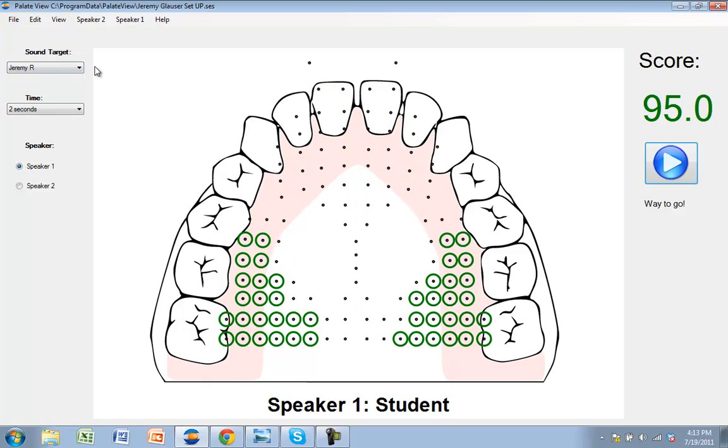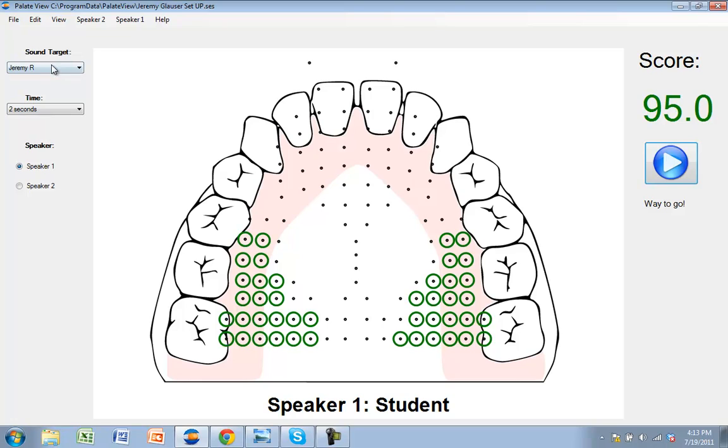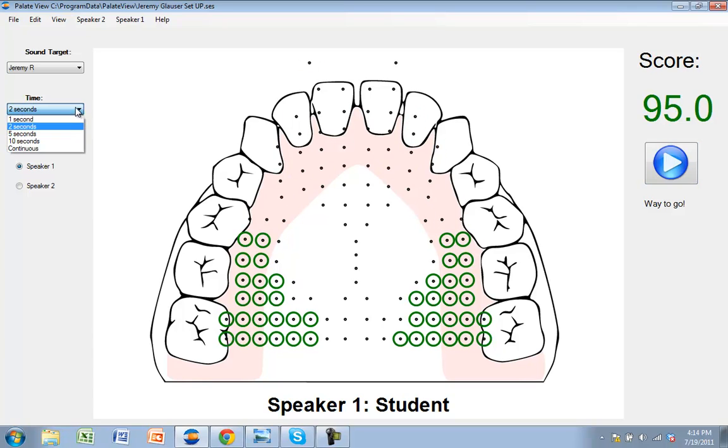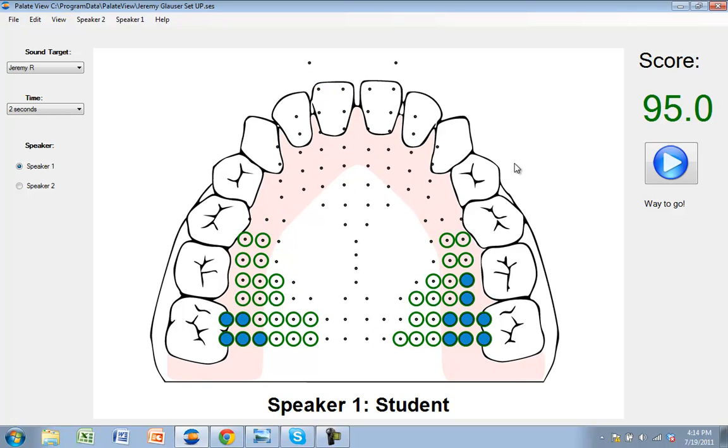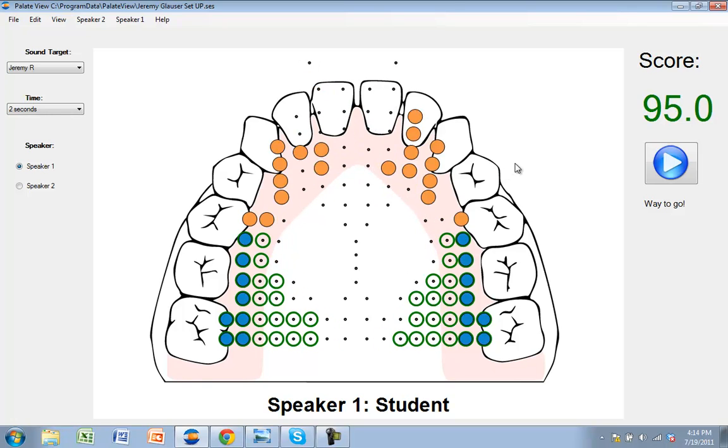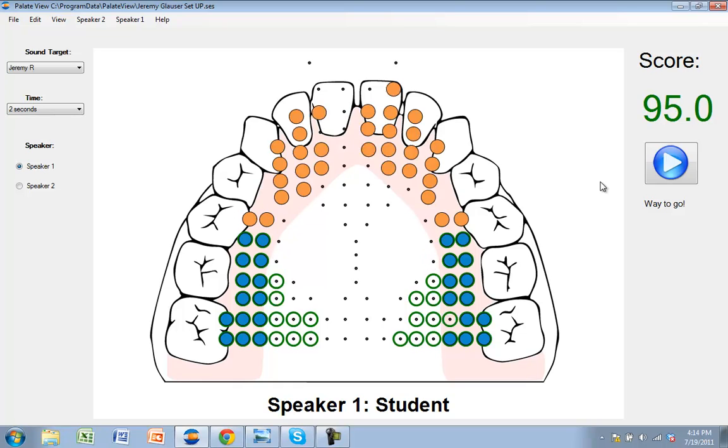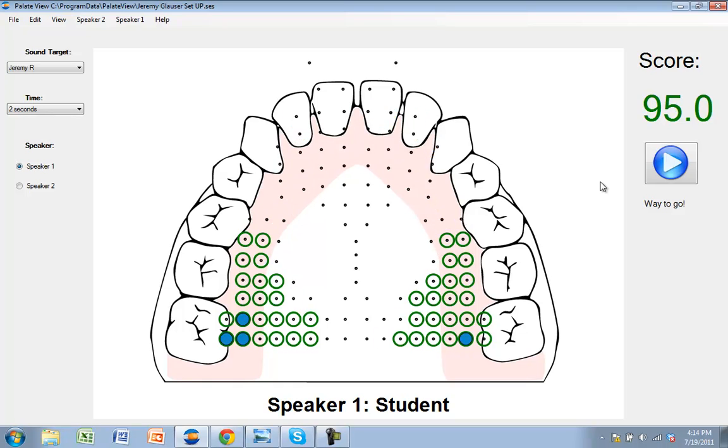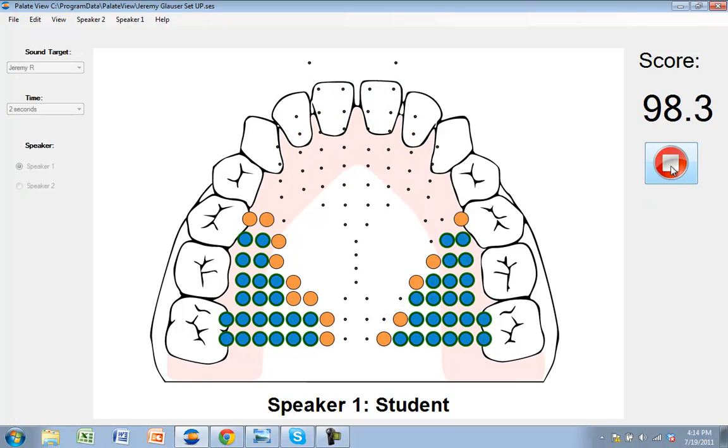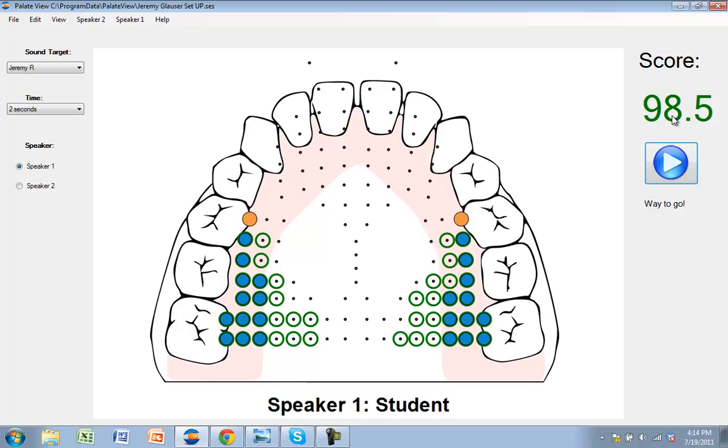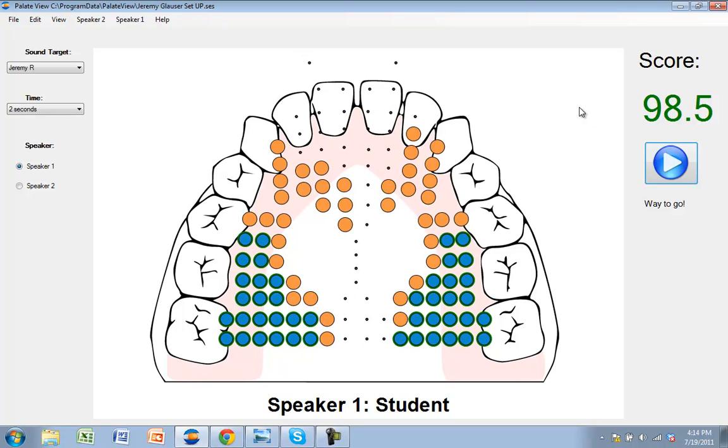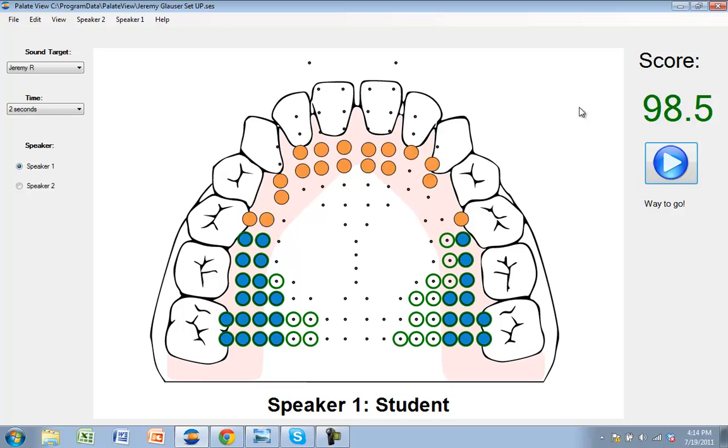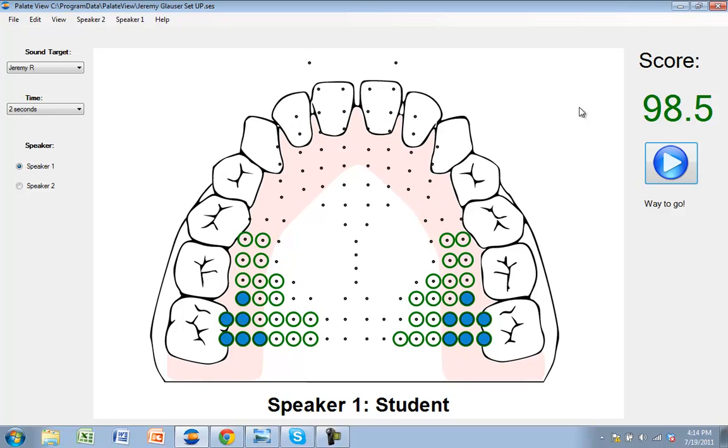Let's show you how to apply this into a word. I'm going to have the sound R brought up here with my green circles, and then I'm going to hold it for two seconds right as I'm saying the word read. I'm going to hold R for two seconds and finish that off with read, making it easy to apply this into standard sequence from a sound in isolation to a sound in a word. 98%. I went from a sound in isolation to a sound in a word. That's great. For you to be able to show your student how well they're progressing is so fun. It's so engaging. It becomes a game for them, and they are able to compete against themselves and progress much faster when we can measure and quantify how well they're doing.